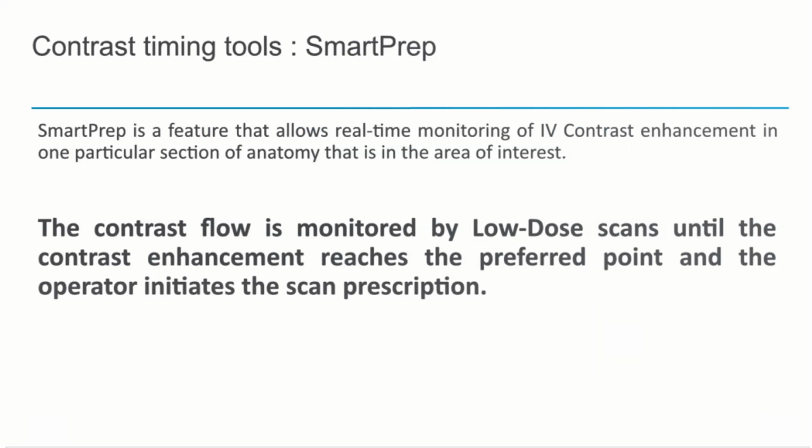So SmartPrep is the name given to GE bolus tracking. So if you have a Philips system or Siemens system, you will find the name of this feature as bolus tracking, or SureStart for Canon. So it allows real-time monitoring of enhancement levels within the vessel of interest over time. So the enhancement threshold can be seen on a graph, and when the threshold is reached, the scan is started, either manually by the operator or automatically by the system.